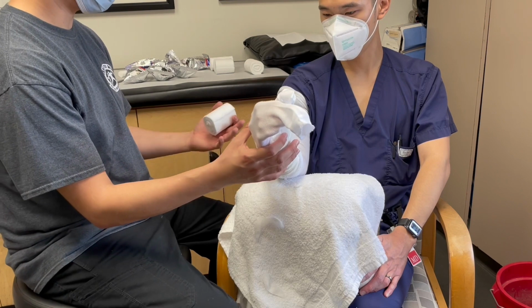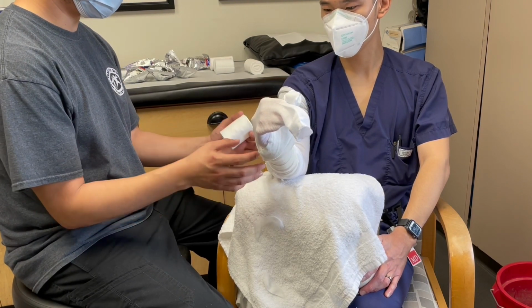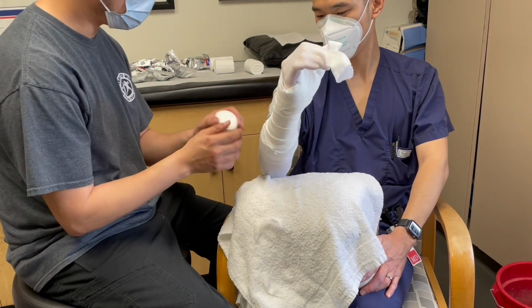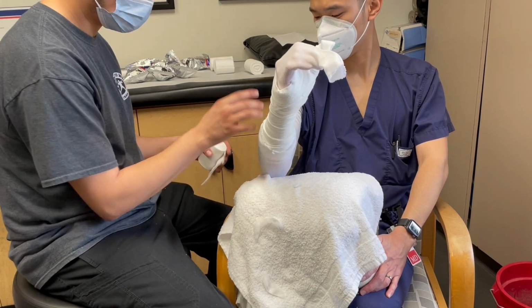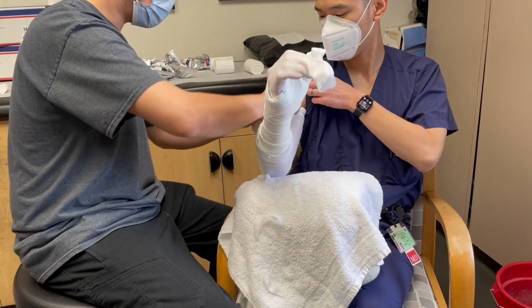For a long arm cast, we should have the elbow in 90 degrees of flexion with a neutral wrist in a slightly extended position. The cast should start from the distal palmar crease and extend approximately at least the mid-humerus. In this view, we go closer to AC and axilla.